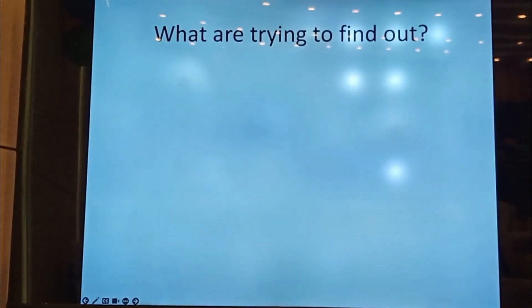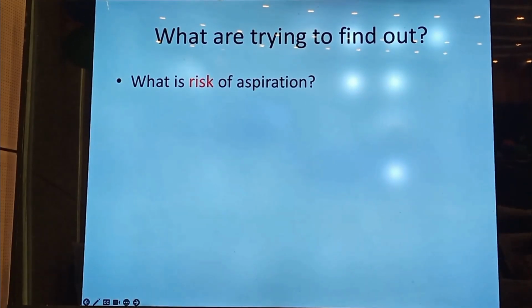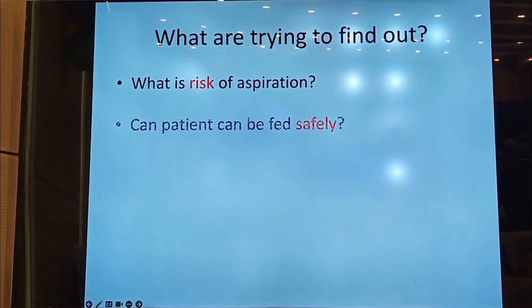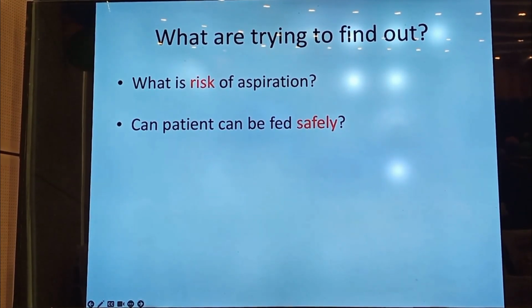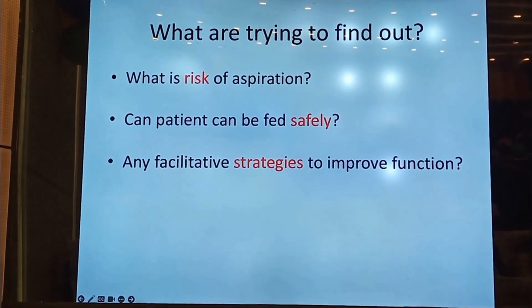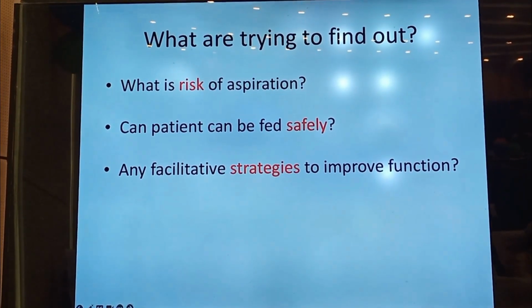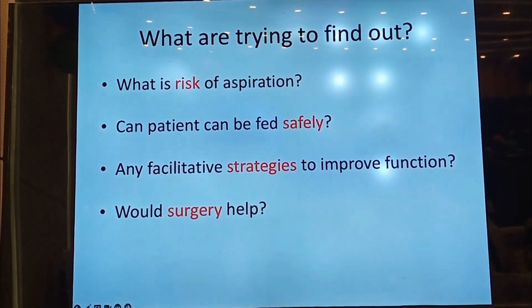What are we trying to find out during a swallowing evaluation? Firstly, we are trying to find out what is the risk of aspiration. Secondly, we want to know whether the patient can be fed safely. We want to know if there are any facilitative strategies that can improve function. And we also want to know whether surgery may be helpful for this patient.